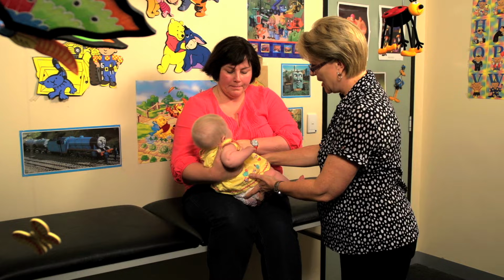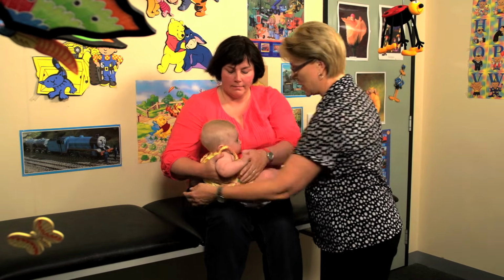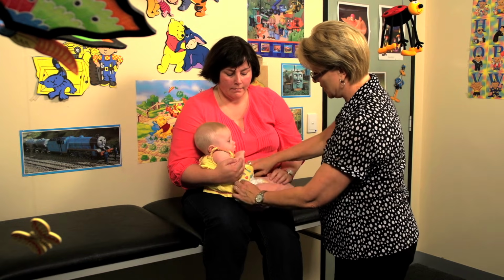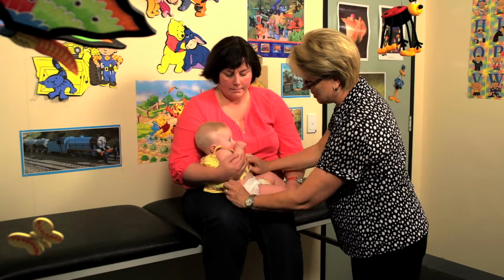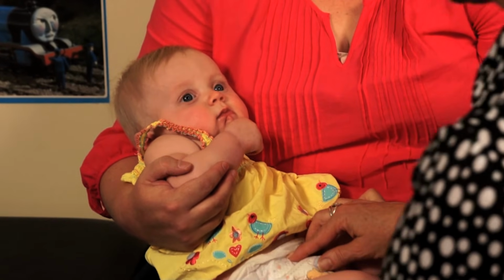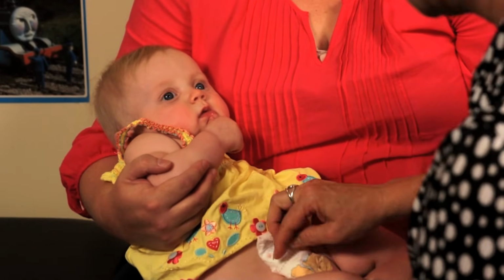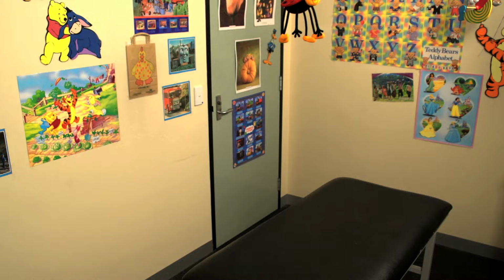When seeing infants less than 12 months of age, you can use this cuddle position. Position the infant in a semi-reclining position on the lap of the carer. The infant's arm that is near the carer will need to be restrained under the carer's arm or against the carer's chest. The infant's other arm should also be held securely by the carer. This helps to keep the infant still. By flexing the infant's knee, you can encourage relaxation of the vastus lateralis muscle.